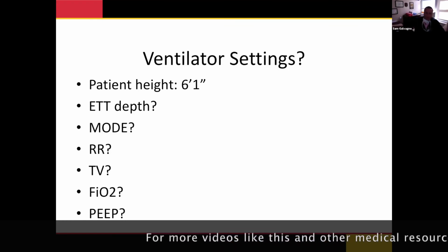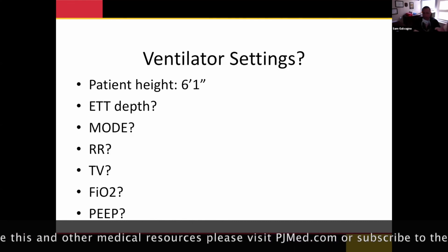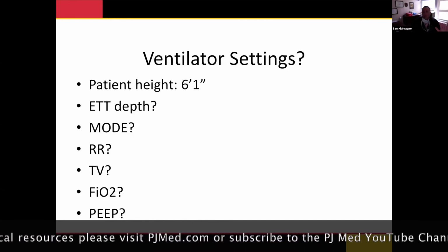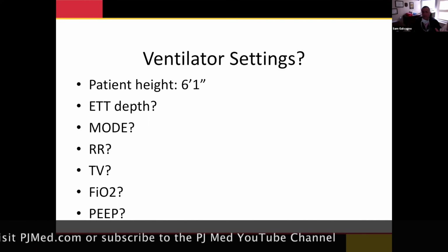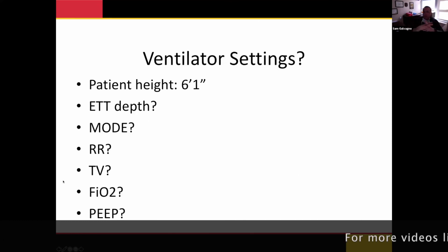on the ventilator. We do not do the old, let's get them on the BVM, give them a couple breaths, get our end tidal, listen for lung sounds. We're not doing that with these patients. We're putting them right on the ventilator immediately. So you may be doing this. So before you go in the room, set this up, get your ET tube depth. This we have found to be a very helpful way to not contaminate ourselves.